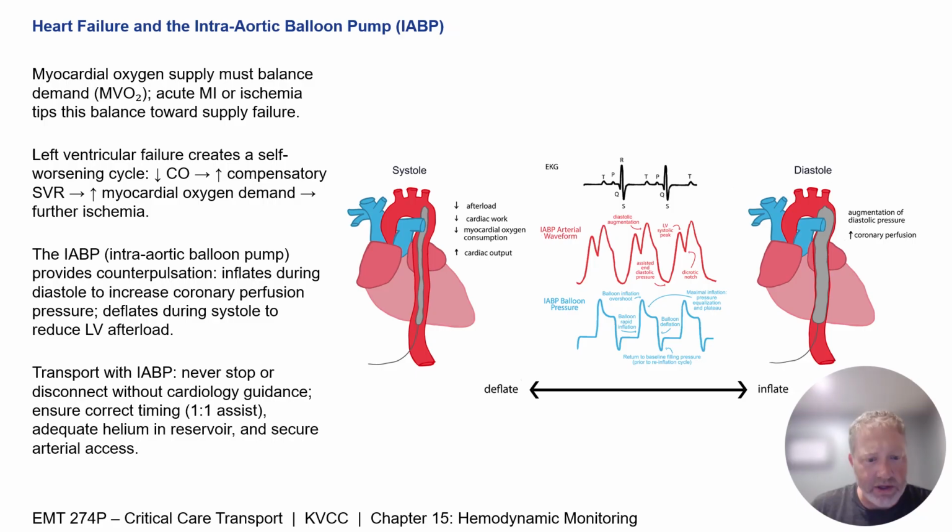But when you're transporting with it, don't ever disconnect it. Don't ever stop it. Just set it and forget it, and make sure that the timing is on and that there's adequate helium in the reservoir, and there's secure arterial access, and keep it as stable as possible.